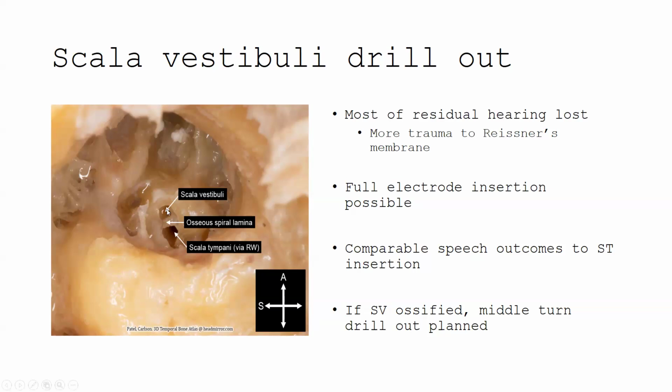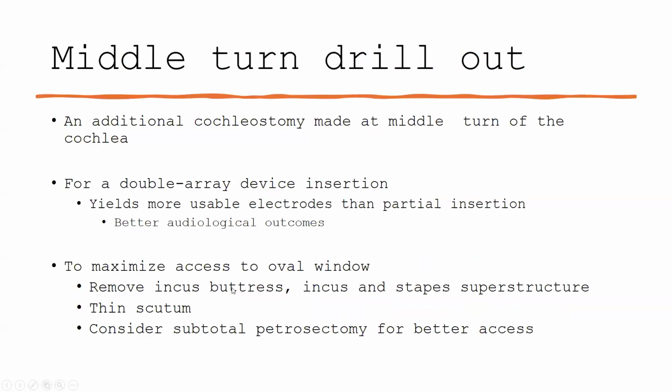However, if we find this also ossified, then we have an option of a middle turn drill out. This is not so popular anymore because of the difficult access to that region.